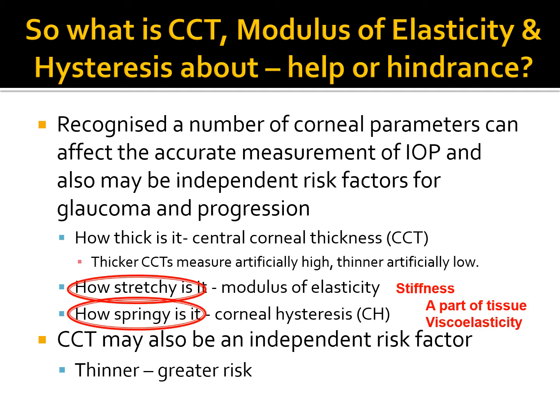How stretchy is it? Modulus of elasticity in biomechanical terms is a measure of a material's stiffness, not stretchiness. And this is again vocabulary. You've got to use the right vocabulary. It's too easy to shove this stuff in and it sounds good. Corneal hysteresis, how springy is it?